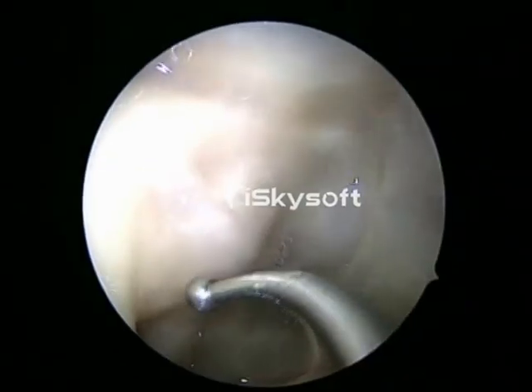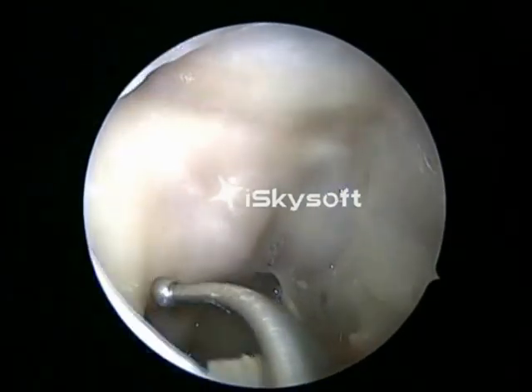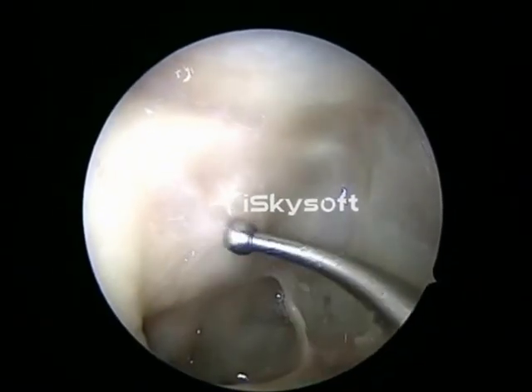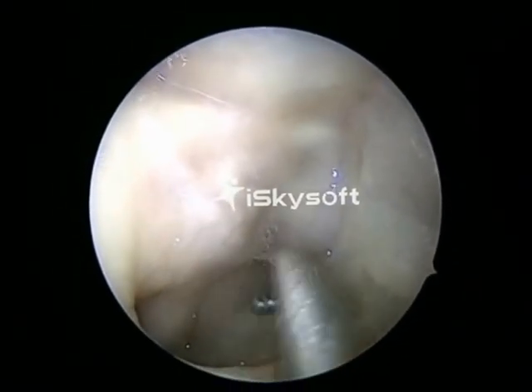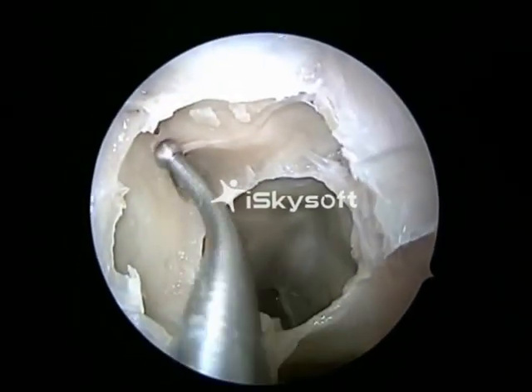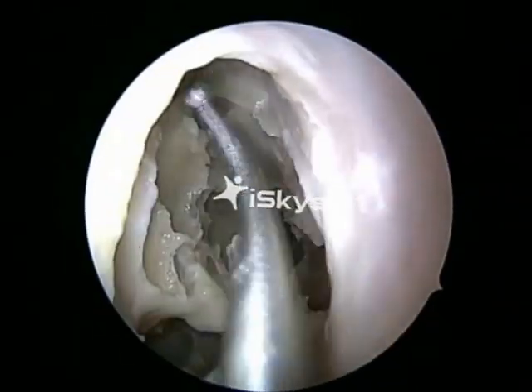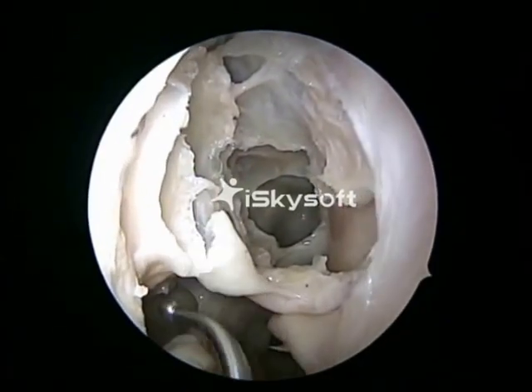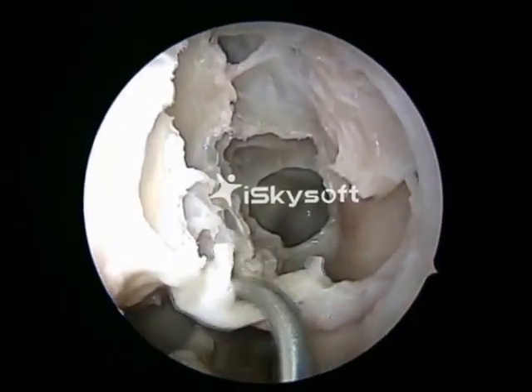That's the optic nerve. That's the internal carotid artery. Very nicely seen in your picture. And that's the sellar floor. That's the posterior ethmoidal vessel, the skull base, and the lamina papyracea.